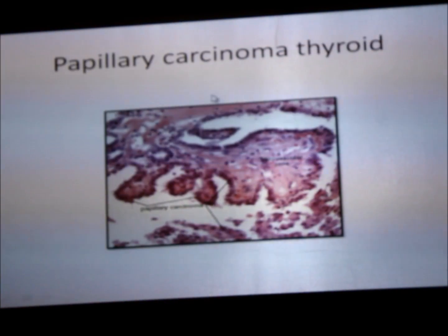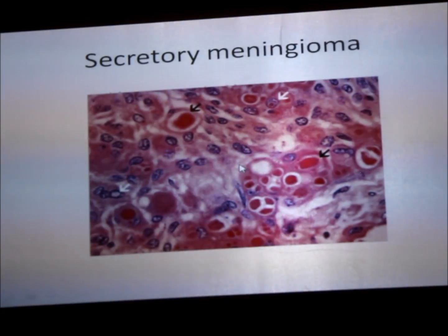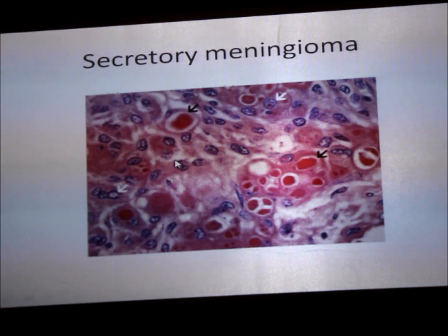What is this? In thyroid, next slide is. What is another next slide for thyroid? Yes, this is Orphan Annie nucleus, papillary structure. All clearing of nucleus can be seen. The moment you see the slide, it is all clear nucleus. Okay? So this is papillary structure with fibrovascular core, Orphan Annie nuclei. It's papillary carcinoma, thyroid. Now in CNS, there is a slide called secretory meningioma.